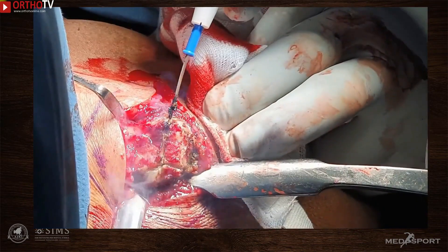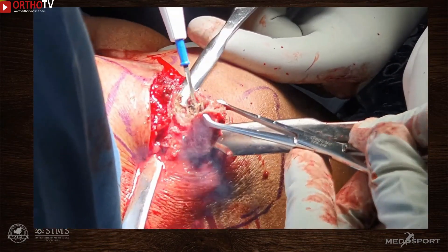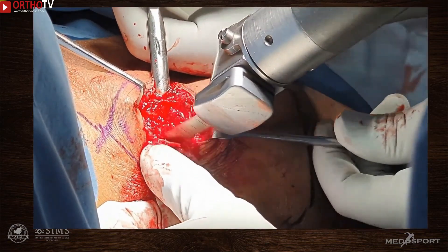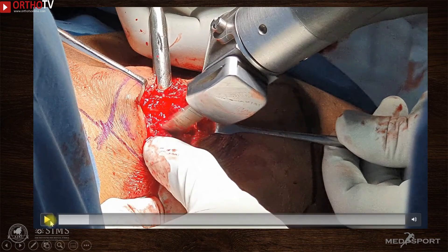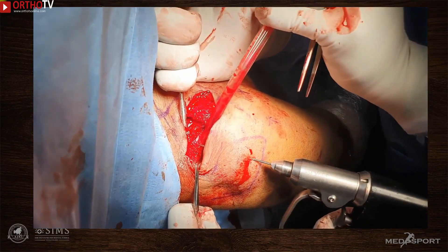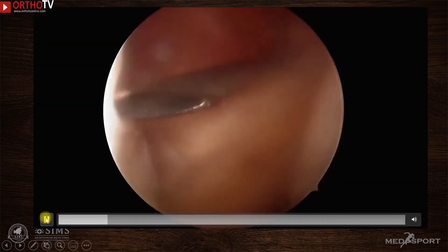Using diathermy, marks are made for excising the lateral end of the clavicle, and the sharp posterior-superior corner of the lateral clavicle is also excised. Excising this sharp posterior-superior margin prevents the emergence of pain due to posterior impingement. The clavicle is then reduced and held with a thick K-wire passing through the acromion and into the lateral end of the clavicle, providing stability during the subsequent arthroscopic procedure and coracoclavicular drilling.